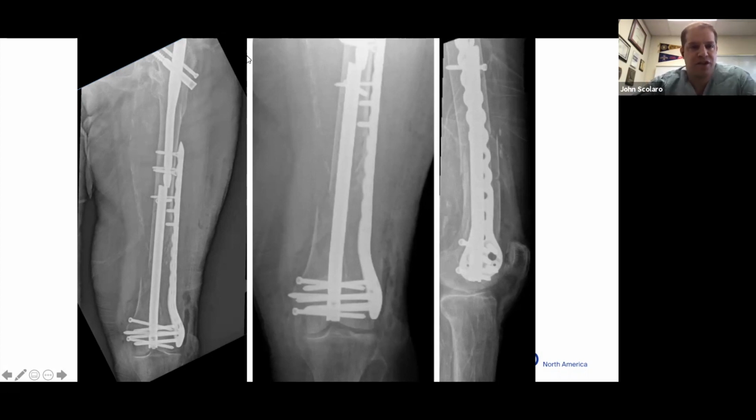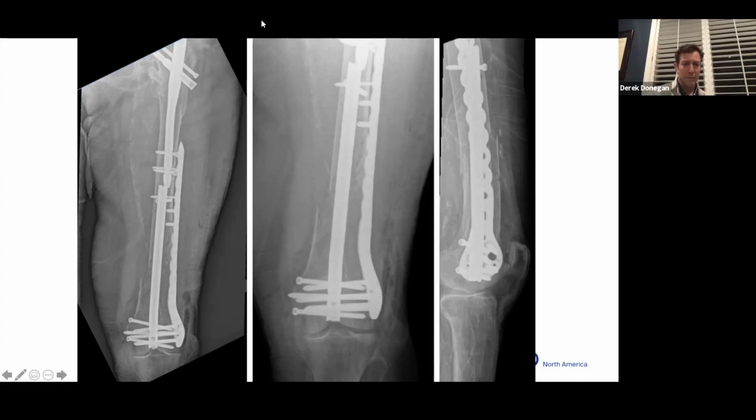My practice has actually changed. I've started to use shorter nails, honestly, for speed and for blood loss. There is something to be said for reaming the canal, especially we just finished up with a patient, a 98-year-old intertroch, and for me, with multiple medical comorbidities, the goal is just getting stable fixation and getting off the table as soon as possible. I've started to use more short nails probably in the last 2 years than before. So yeah, it's whichever complication you want to deal with.